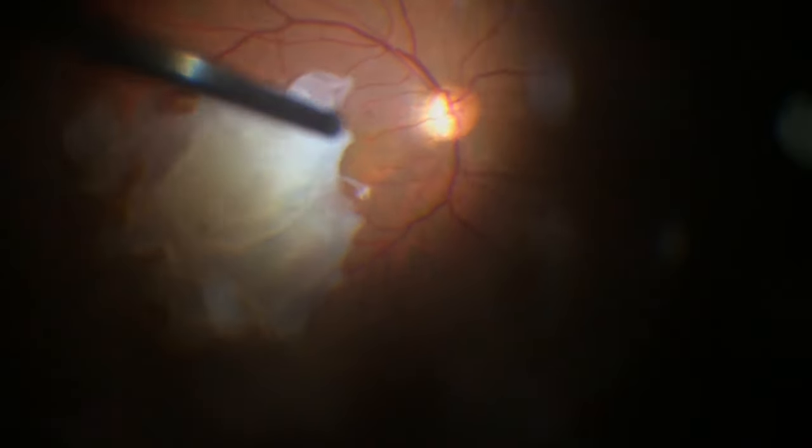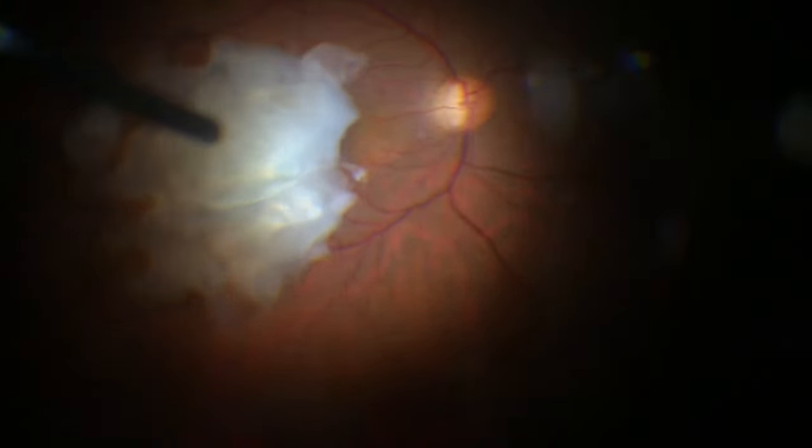One has to be very careful when cutting vitreous attached to the retina, because any traction can cause formation of a break. This has indeed been a possibility here — a break was timely recognized and lasered.